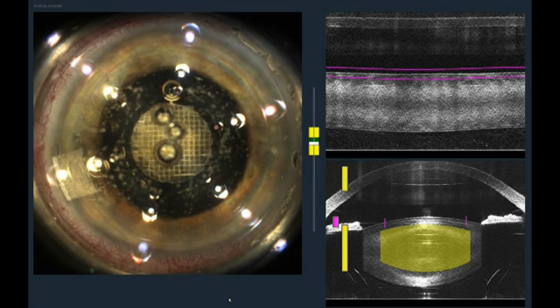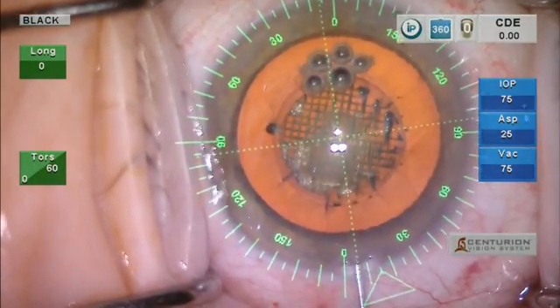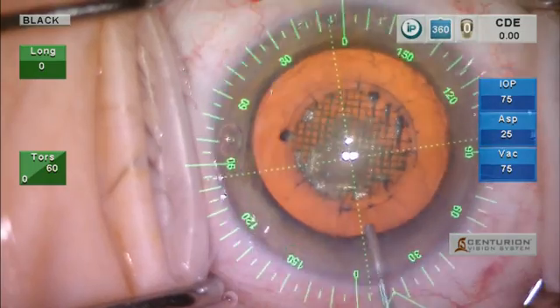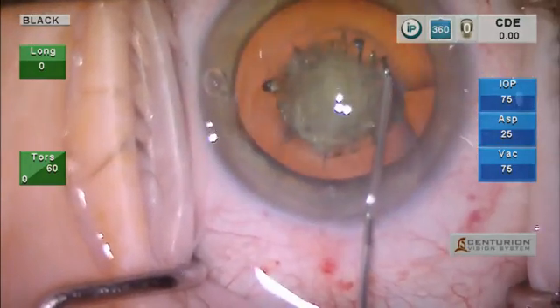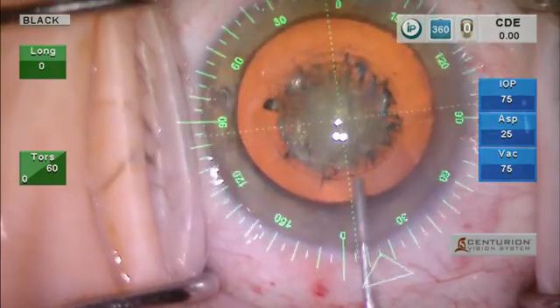We are all finished. You can see the very nice complete capsulotomy here with a gutter 360 degrees, indicating a free-floating capsule. I still document that after I inject viscoelastic on top of the capsule to make sure that the capsule is free.